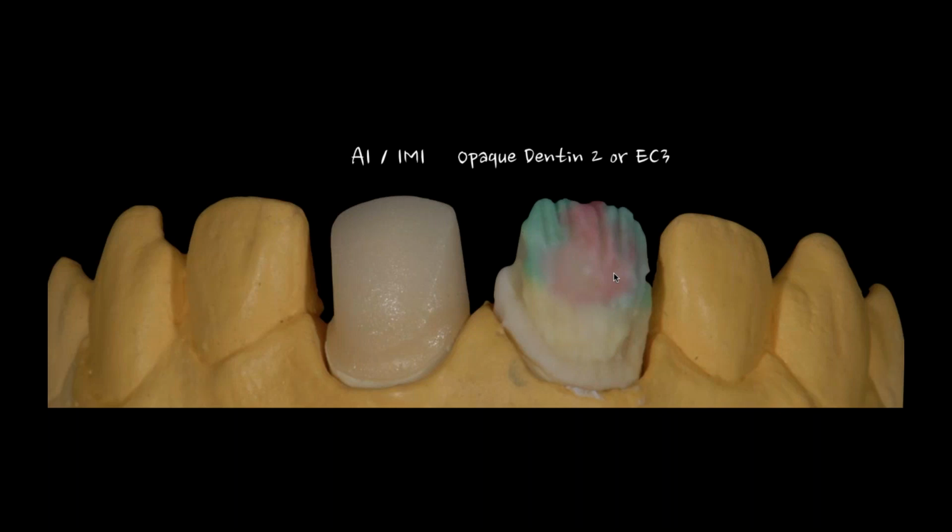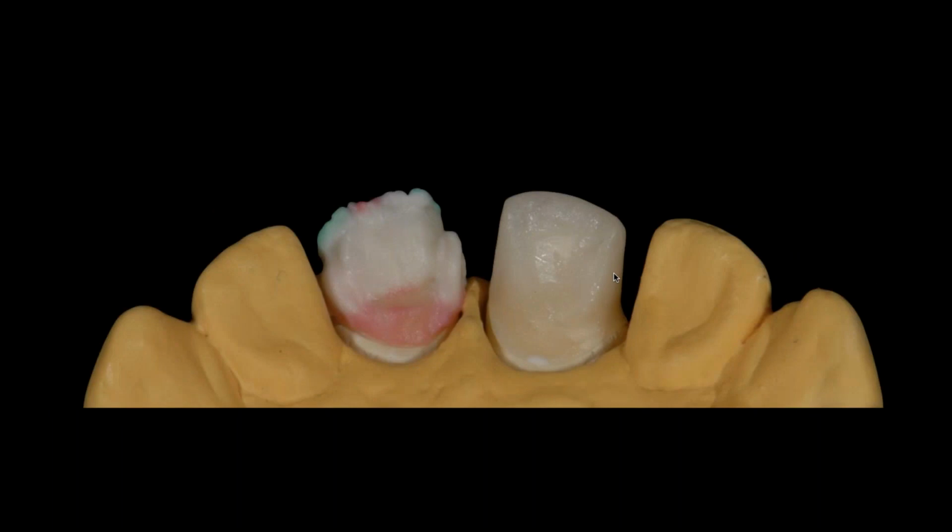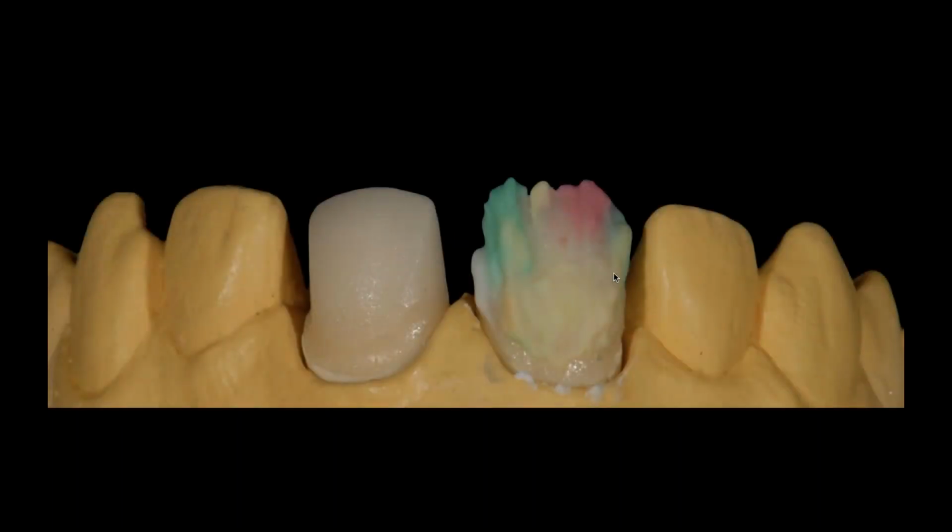Now, I use 4 powders to do that. Some of you say, well, that's more powders than I use in general. Some of you say, I get it, I need another 4 after that. I'm going to simplify it. I'm only going to use those 4 opacious materials. So here is the final buildup of that. And I'm actually going to fire that.